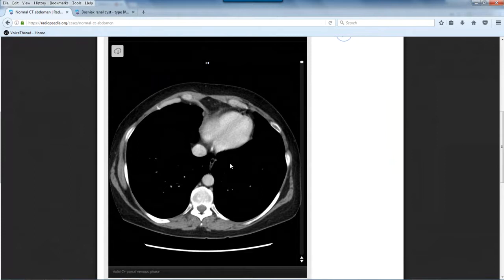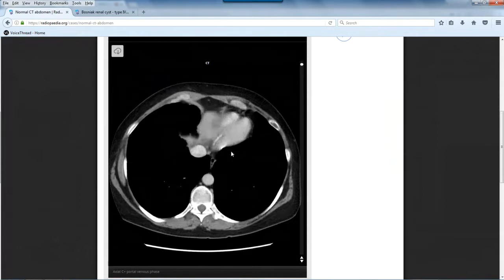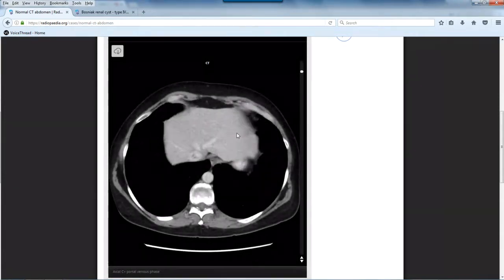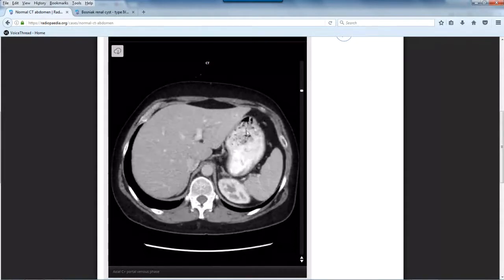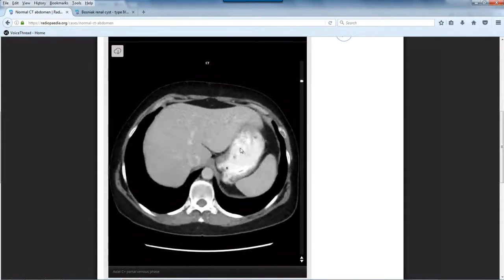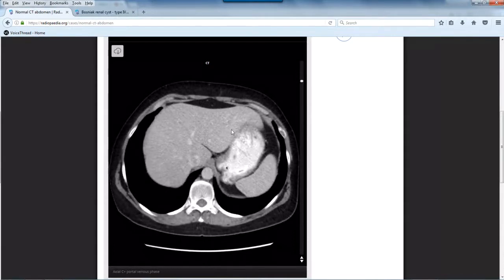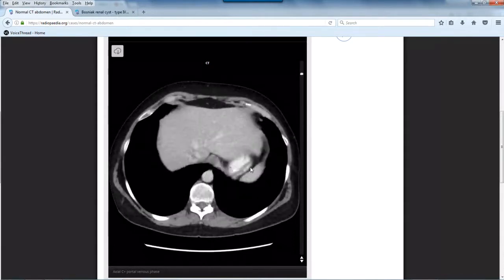We're going to look for the stomach now, which we went over last week, but we went into more detail this week. So first you want to look for the fundus, which is the most superior portion of the stomach. It's going to be to the left of the midline. So here's the most superior portion.